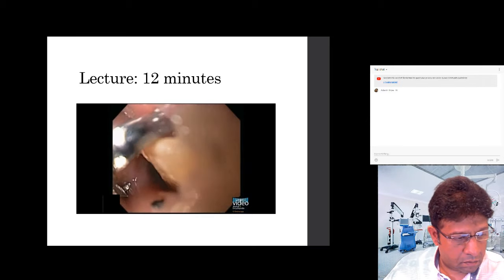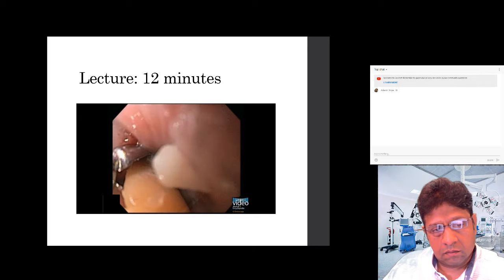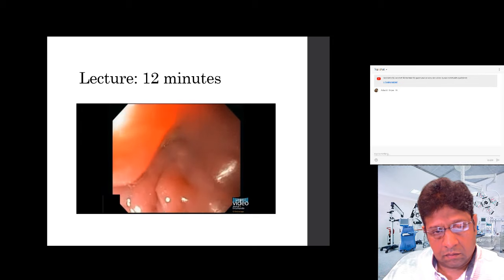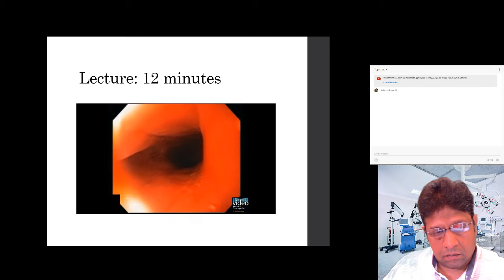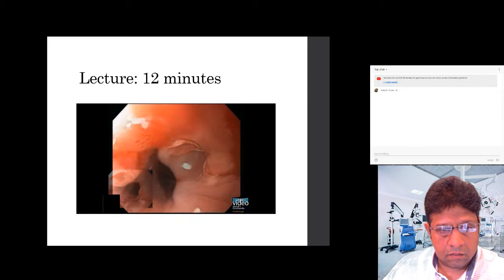In this case, we are using an endoscopic grasper to capsule the impacted denture and gently disimpact the object. With a slow pulling force and fine twisting of the endoscope, the impacted denture is removed without event. Endoscopic examination of the upper esophagus and esophageal introitus reveals several ischemic ulcerations from the impacted denture.